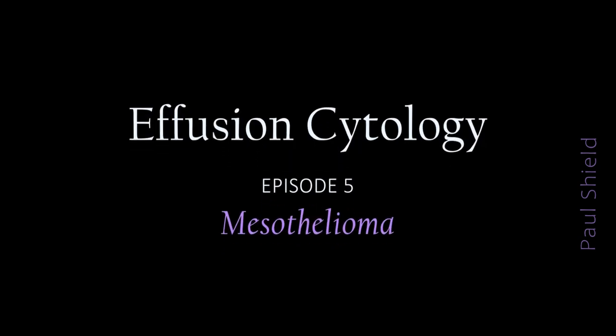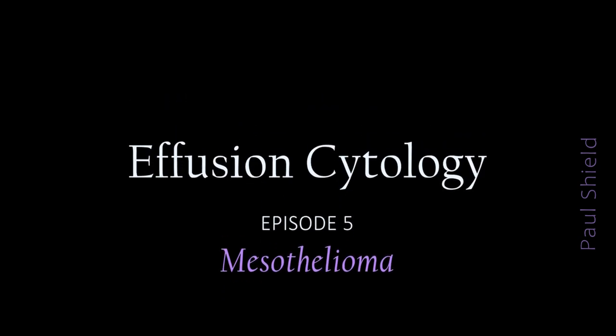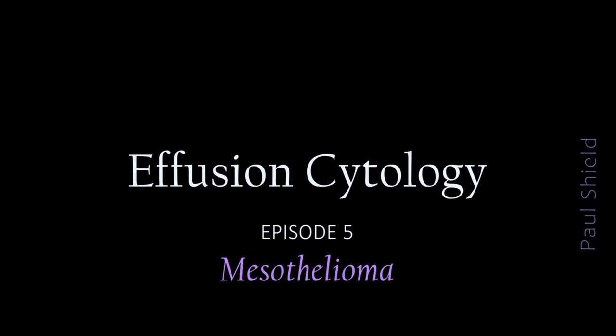Hi everyone, it's Paul. Let's look at mesothelioma. So this can be quite a tricky diagnosis.